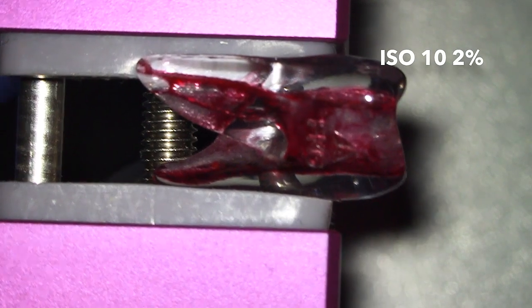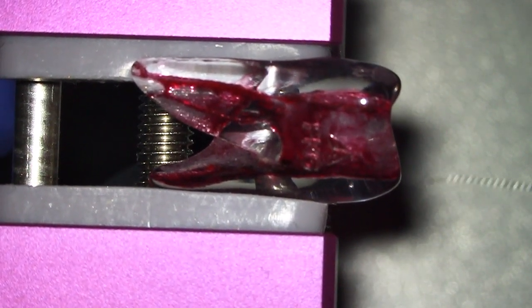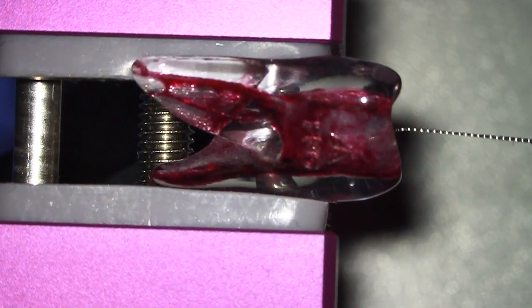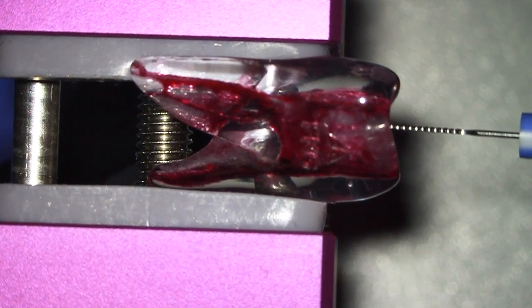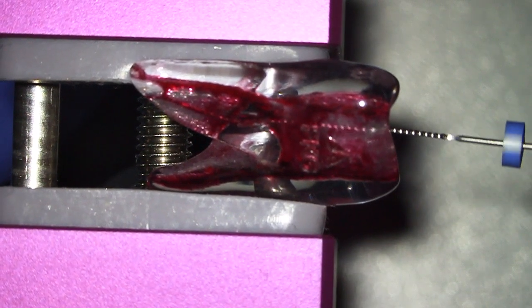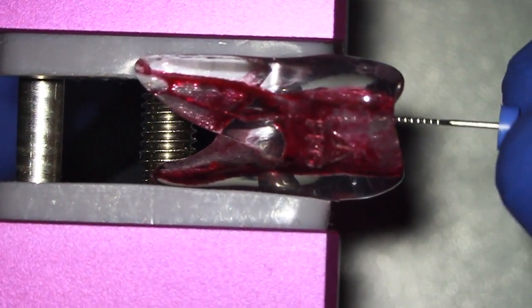The same procedure is performed in the second canal. Remember that in narrow and curved canals, the pre-bending of the tip of a file is strongly recommended to avoid ledges.